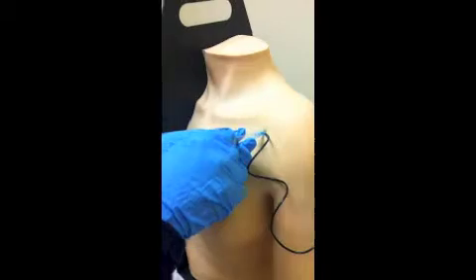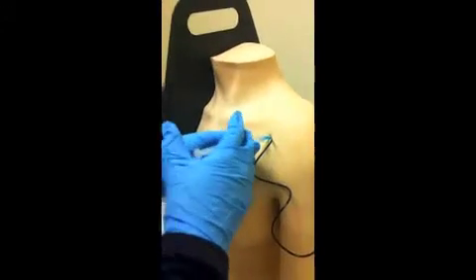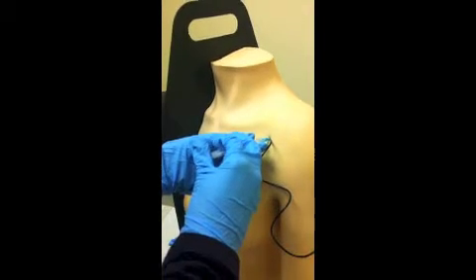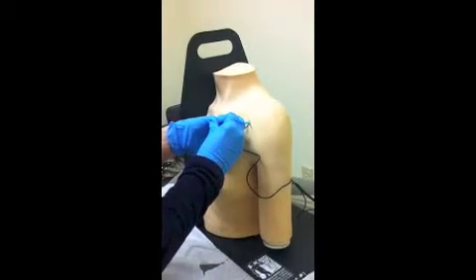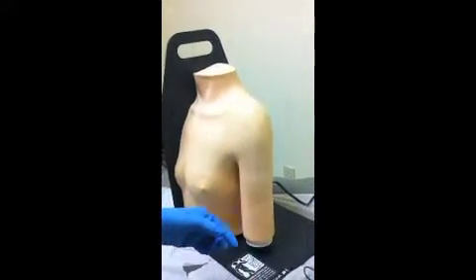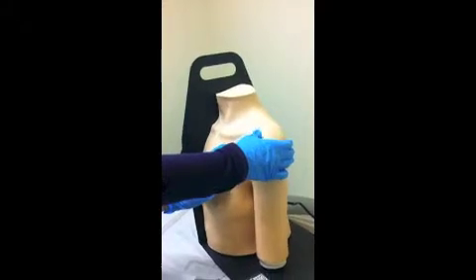It is important to aspirate back to make sure that we don't have any blood return, and I didn't feel any resistance or hit any bone, and no blood return in my syringe. So I will inject our steroid solution. Slowly, not meeting any resistance. Okay. Taking that out. And then putting the Band-Aid on, which you will leave on for the first 24 hours. Alright, so now we can talk about your follow-up care.